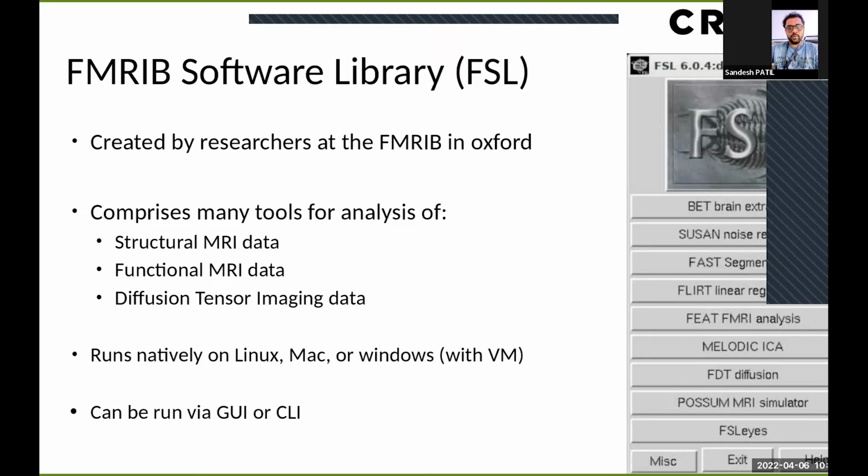It lists all the programs that Fsl has. These programs can be as simple as mathematical operations on images, for example, adding two images or splitting a 3D image into 2D, or it can be as complicated as a registration of multiple images to a template or a set of images using very high iterations, which on a normal local computer with moderate resources can take up to hours, sometimes even days.